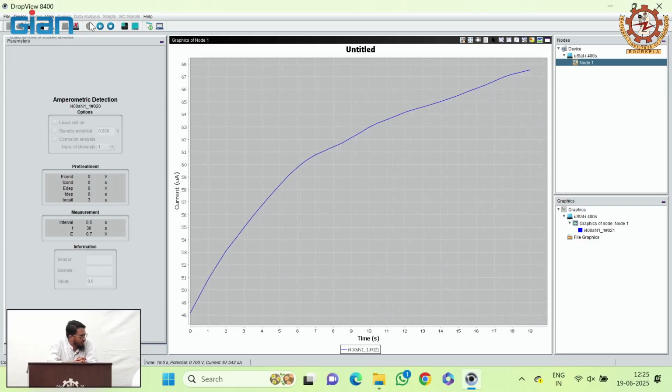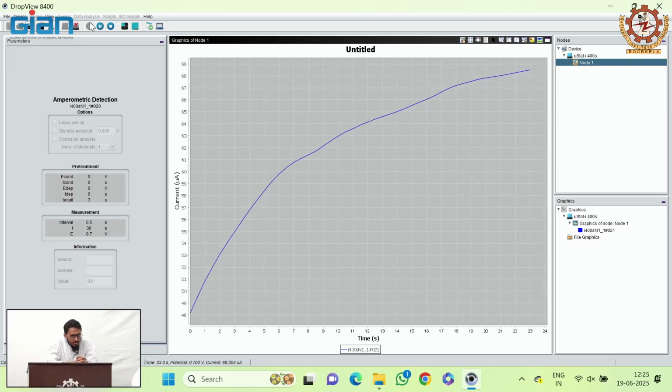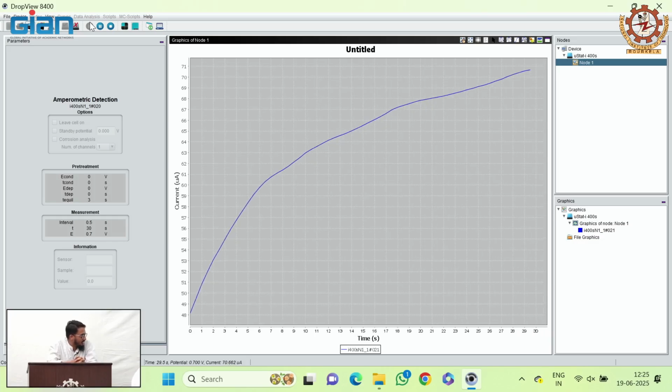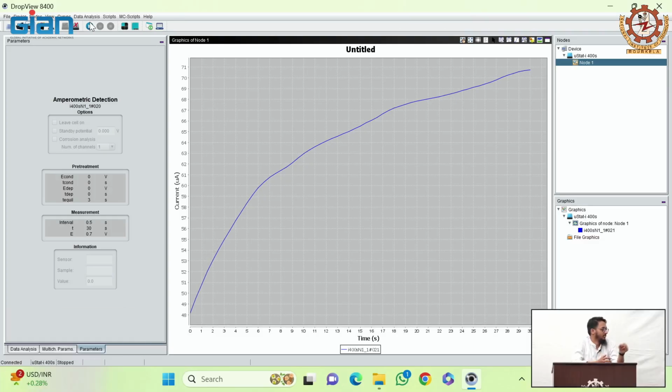So at the end of the 4-step calibration, we will plot a straight line and see if it is working or not. If not, we'll do it again in the next session. Done. 71 microamps. Switch to the, yeah.